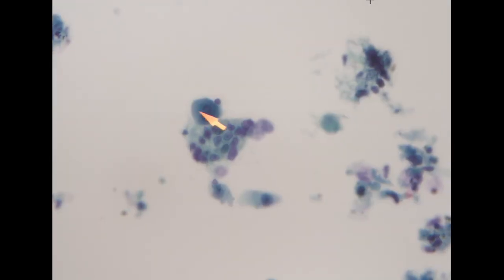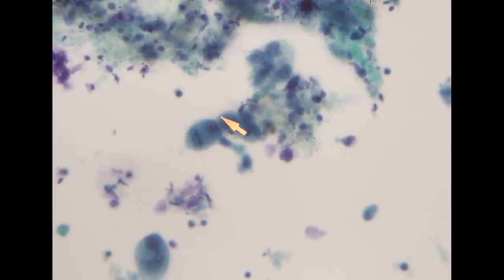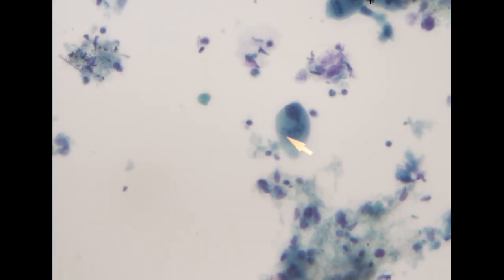These are mostly loosely cohesive in single cells. And I think the nuclear atypia is very prominent. You see, this is a giant cells, like a very atypical tumor giant cell, also here.